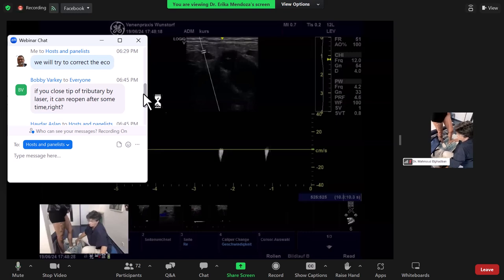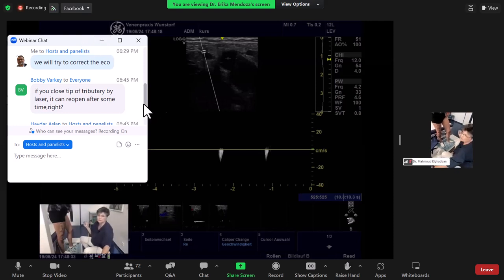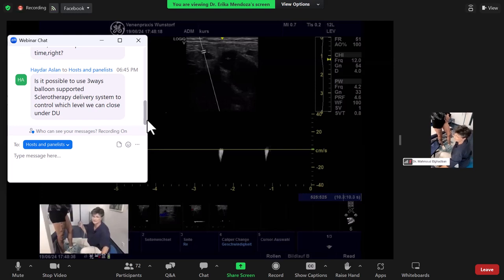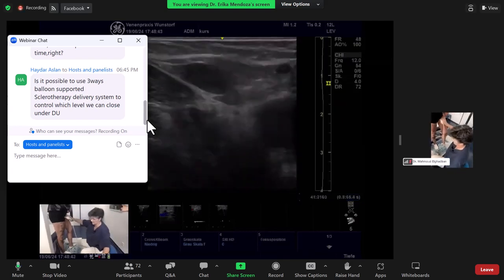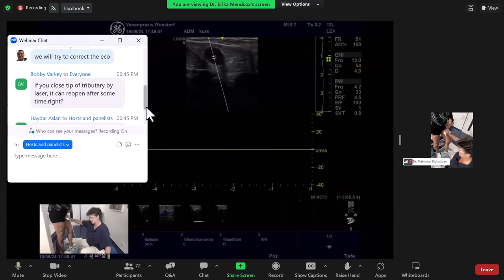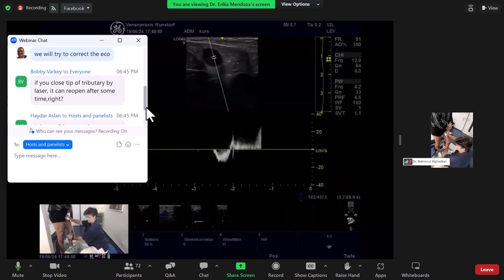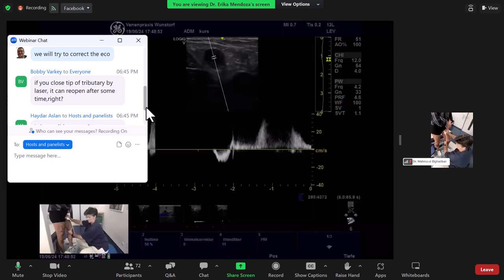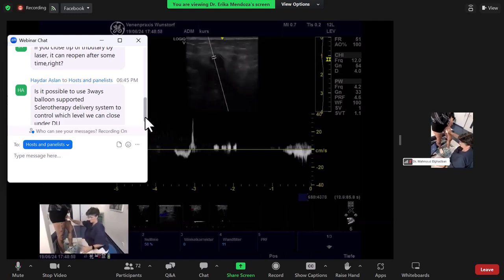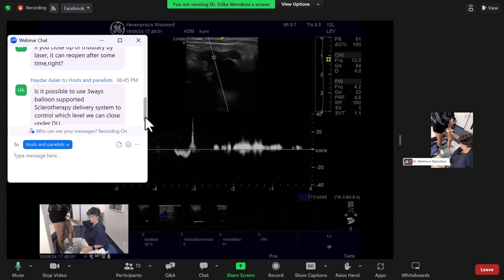If you close the tip of the tributary by laser, it can reopen after some time, right? This is his question. Recurrence can happen after laser, like the GSV can reopen. I mean, that happens after laser, but it is very seldom. It's below 1% in my office. If you destroy the intima with a good laser, recurrence is also possible, but very, very slim. And with the recent European guideline for venous disease 2022, laser is the first option for therapeutic treatment.